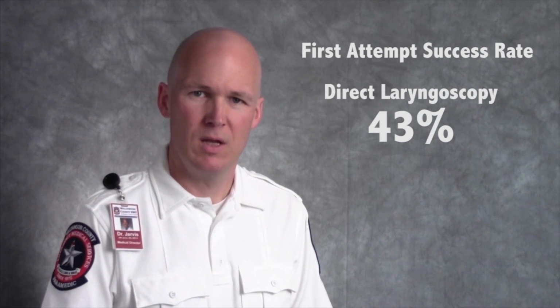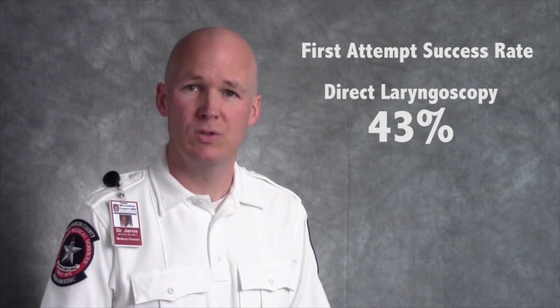Before implementation, our first pass success with direct laryngoscopy was 43%. Our first pass success for 2013 using the King Vision exclusively was 83%. To give you a little perspective, there was a nice registry study published by Dr. Sagarin in Annals of Emergency Medicine in 2005, and it showed a first pass success among emergency physicians of 83%. While we're not yet satisfied with our performance, it is definitely a marked improvement over where we began.